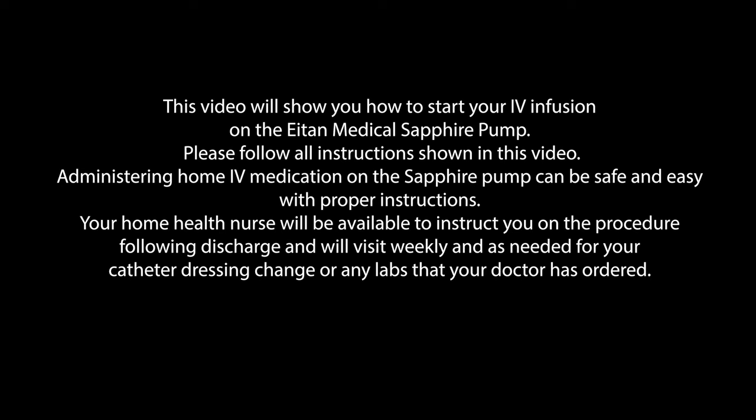This video will show you how to start your IV infusion on the Eitan Medical Sapphire Pump. Please follow all instructions shown in this video. Administering home IV medication on the Sapphire Pump can be safe and easy with proper instructions.